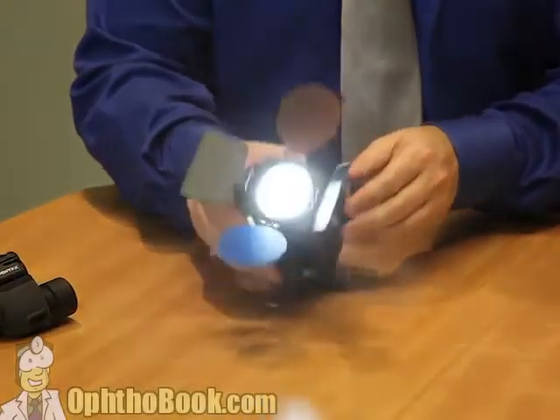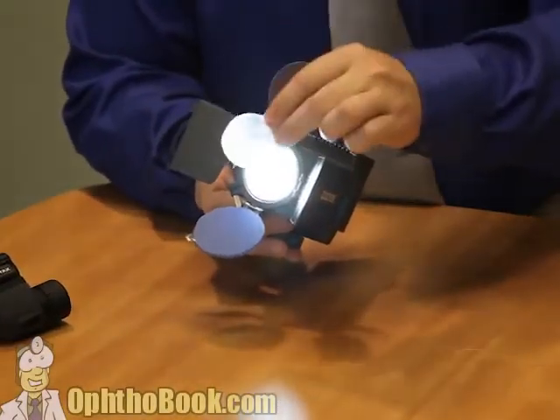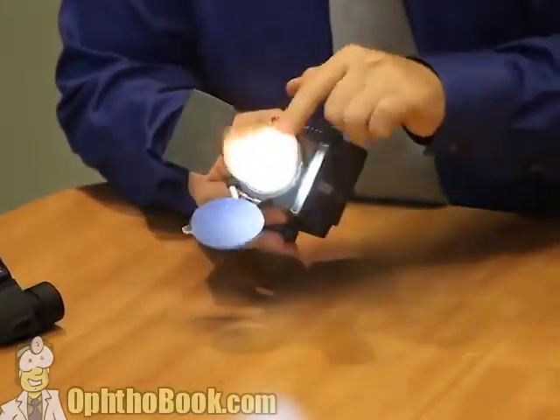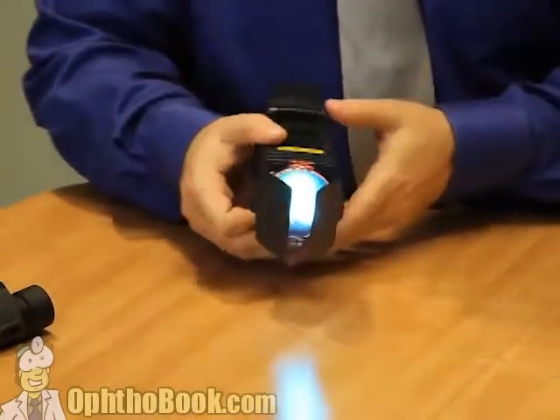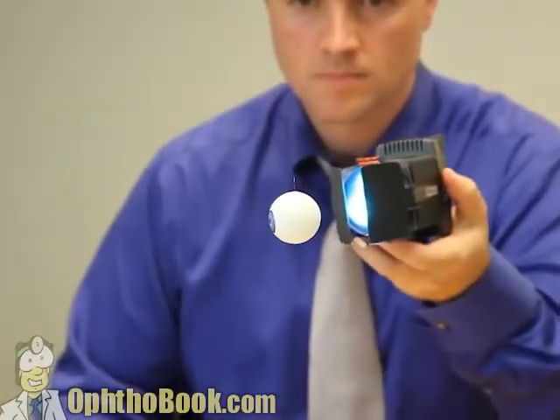But what if we improve our light, put it in some type of housing so that it's very bright? In fact, we can even focus our light using a lens in the front. We add some filters onto the light in order to look at different structures in the eye. And we can even put barn doors so we can create a slit of light, a beam of light. And this is a better way to look at the eye. And now we have basically an excellent light source.